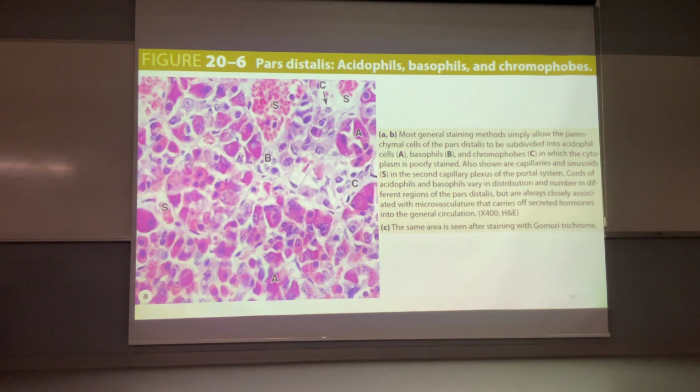Guys, all of these cells have nuclei, which are stained in purple. Here you can see all of the nuclei. We talk about the cytoplasm color, not the nuclei. When we look at the cytoplasm of this cell, for example, you can see acidophilic color, or pink color.